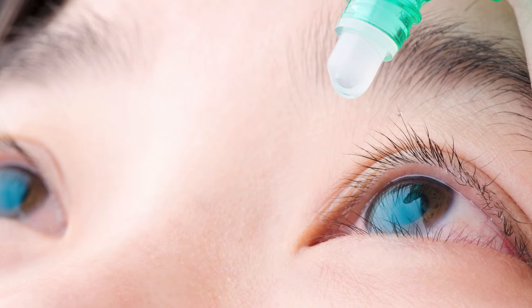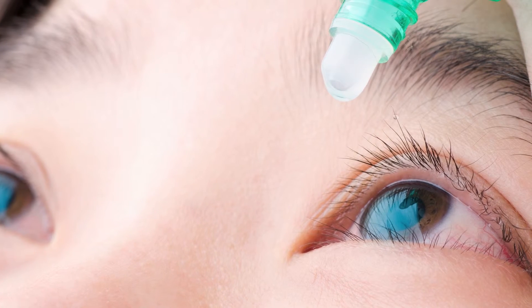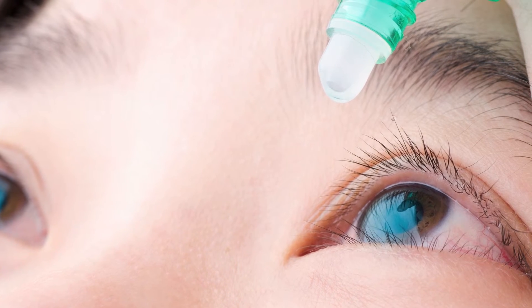When you are going to have angiography, special eye drops are put into your eyes to make your pupil dilate or widen. Then your ophthalmologist or an assistant will insert a very thin needle into a vein in your arm and inject the dye. As the dye passes through the blood vessels in the retina and choroid, a special camera will take a series of photographs to be reviewed by your ophthalmologist. The entire procedure usually takes less than 20 minutes.